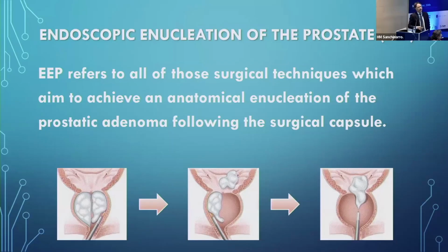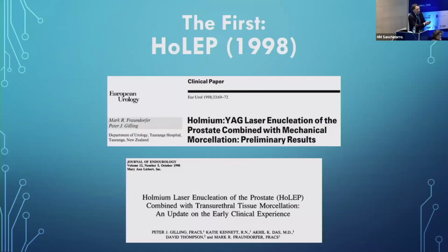So I'll be very fast here. The big application of laser is enucleation, but it started also 10 years ago with vaporization, mainly with green light. And the first we had was HoLEP. So with the holmium enucleation, we saw a beautiful procedure done with holmium today.